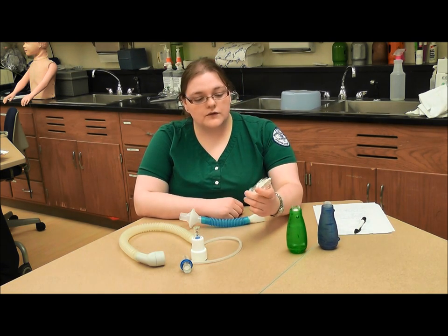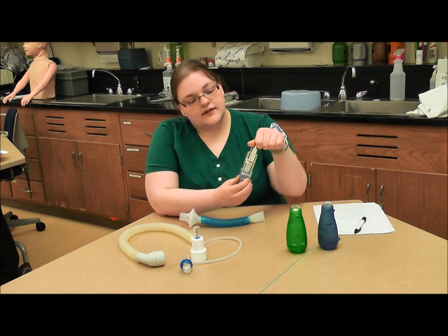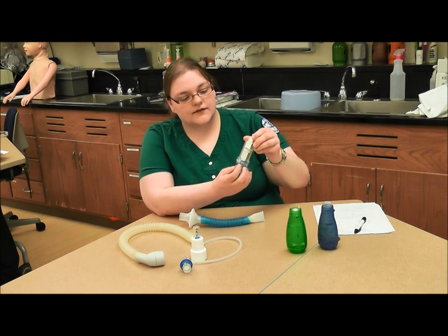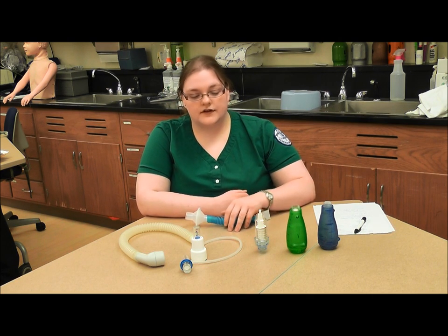Next, we have a threshold PEP device. To operate this, you twist this white piece up and down, and that changes the pressure that the patient has to exert against the threshold to create the positive pressure.